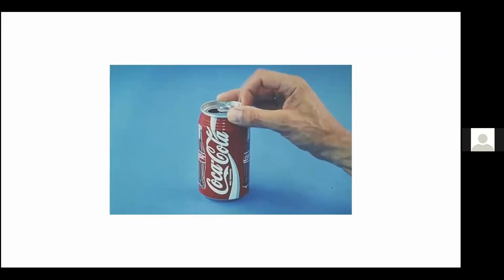So this is the demonstration. This is the coke can. This is Prof. Mayer's hand trying to demonstrate this. So in our labor wards, yes, other people use metal, but we can keep the coke cans, and we're going to use the coke cans to flick and to do the acoustic stimulation and see how the fetus is going to respond to that acoustic stimulation. That is your test to say, if it improves, then everything is good. If it remains flat, then you can say that this is pathological.